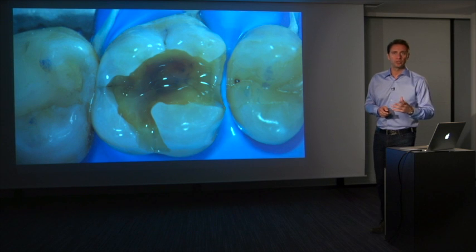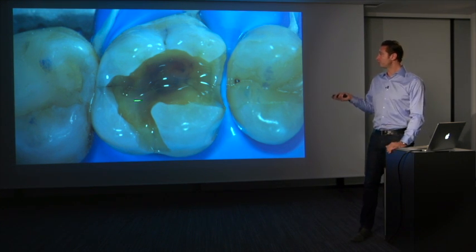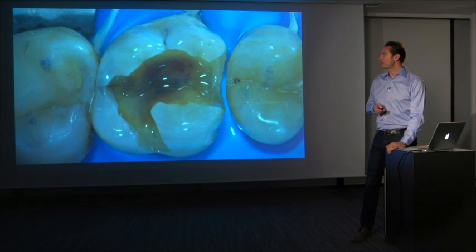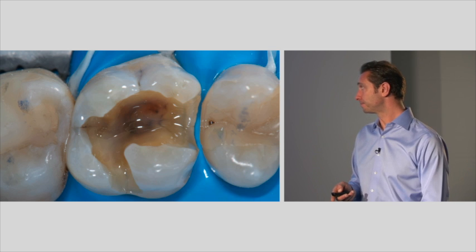It's not necessarily needed, you could immediately bond your restorative material to the freshly bonded dentine, but it creates security that you have a good adaptation of the material to the base.